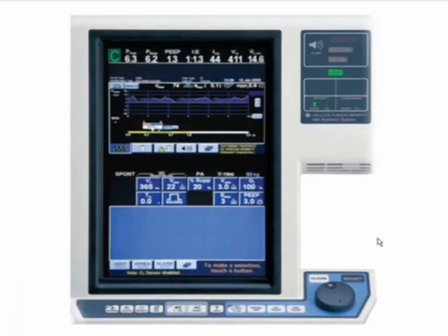So this is just one ventilator. Essentially what you do is you've got to find the inspiratory hold button on your ventilator. It's in the lower right corner in this one, and it's in your handout, but you've got to find it for your own ventilator. They all have an inspiratory hold button. And what you do is the patient gets a breath, you hold down the inspiratory hold button, and somewhere on your ventilator screen, it will tell you what the plateau pressure is.